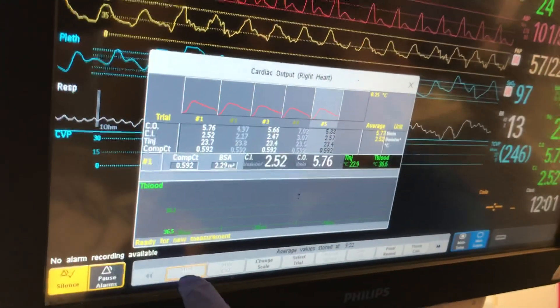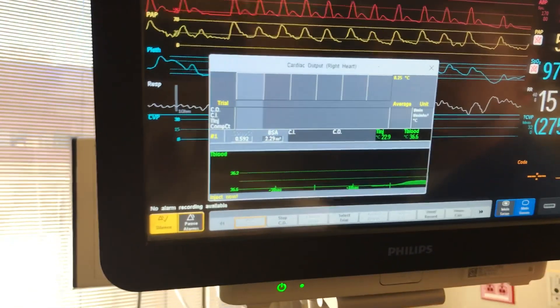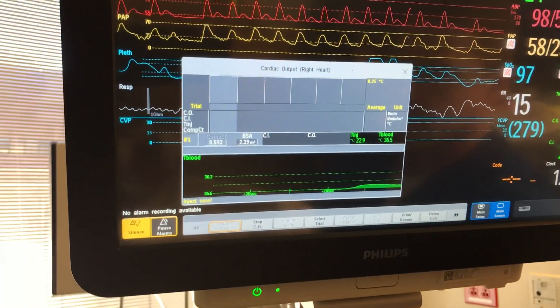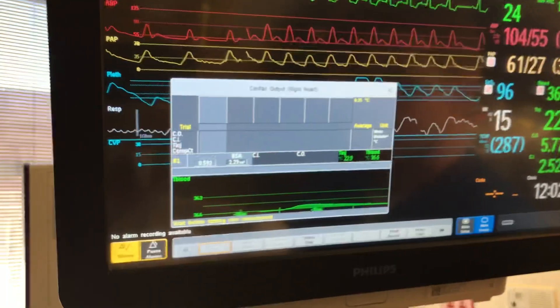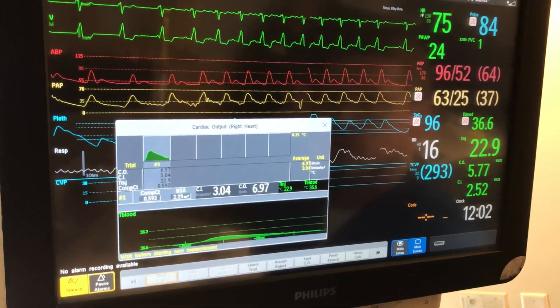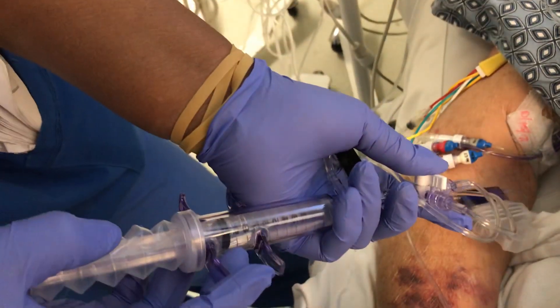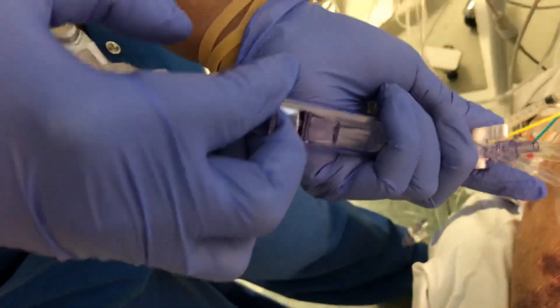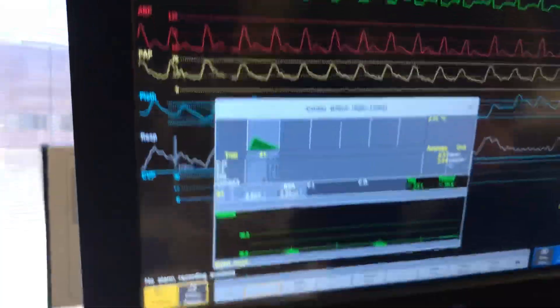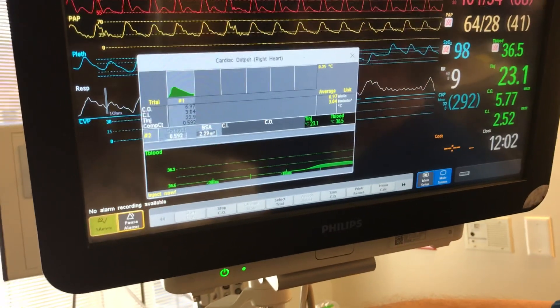So you hit the start CO button. You'll hear a beep and it'll say inject now — and that's when she'll push. And you've got to push it within four seconds. Let's force it in four seconds. And then you wait until it — wait for the tracing. You can do this three to five times and you take your best average.